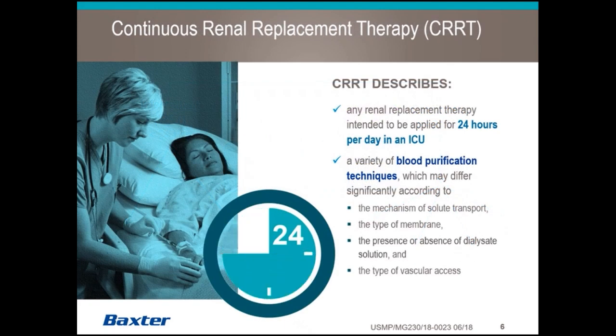This is a general broad definition for CRRT. It's any renal replacement therapy intended to be applied for 24 hours a day in an ICU environment. But CRRT is not simply ICU dialysis. It actually employs a variety of blood purification techniques, which may differ significantly according to the purpose that the doctor wants to accomplish. What type of solute they're trying to remove from the patient's bloodstream, the type of filter that's being used, the presence or absence of dialysate solution, as there are therapies in CRRT that do not use dialysate solution, and the type of vascular access that's being used.